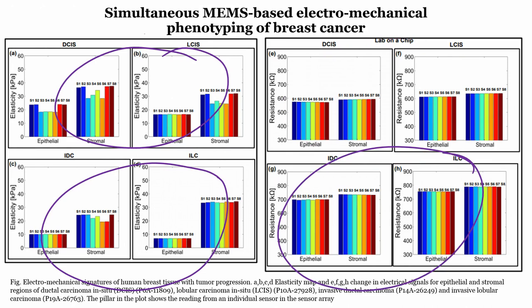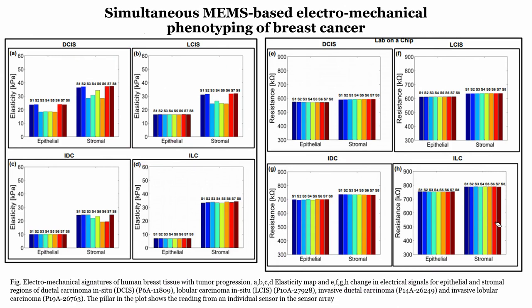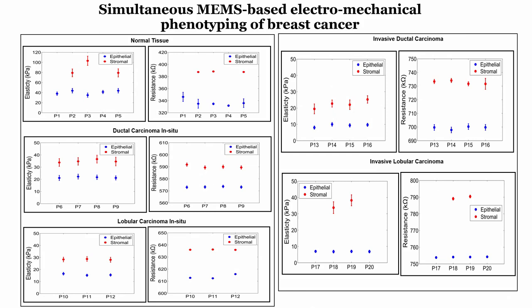So, the sensor can not only delineate between epithelial and stromal region, it can also help us to understand how the cancer progresses and what the changes are in the elasticity and resistance values as the cancer progresses, or from the different stages of the cancer, right. If I put it in this particular format, you can clearly see that from patient 1 to patient 5, if I take a normal tissue, then I can understand the change in the elasticity and change in the resistance. But if I go for a ductal carcinoma in situ, my elasticity values are coming down, right. And if you go for IDC, my elasticity values are even coming down, while the resistance values are going up.